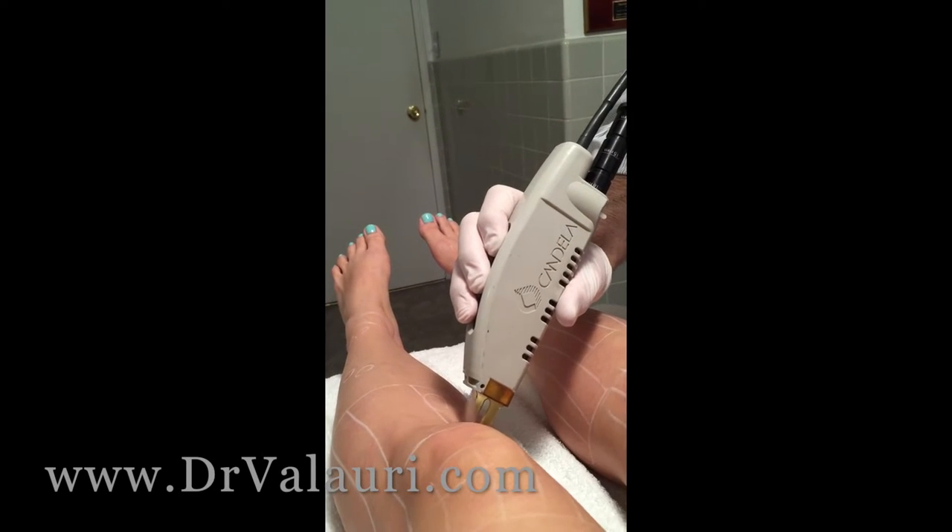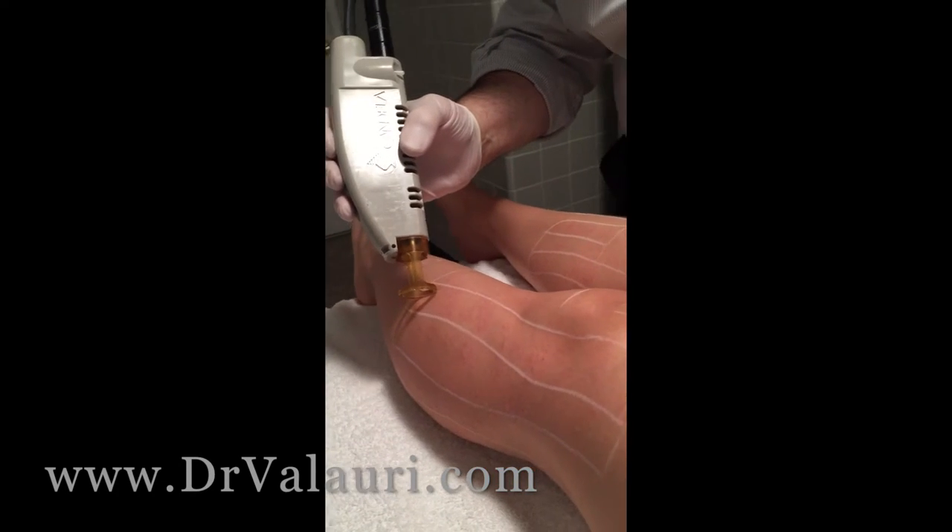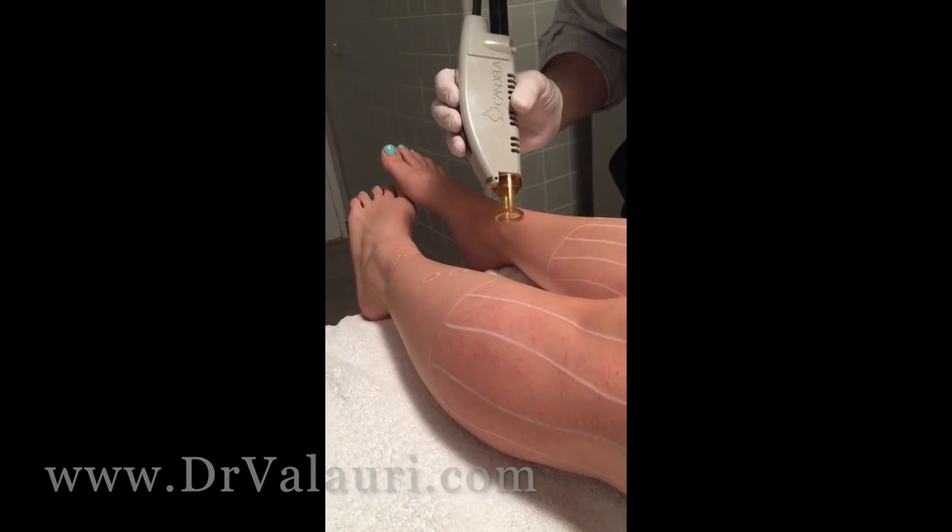What you're going to observe here, if you look, there's going to be a red raising here. This is where there's swelling within the hair follicle.